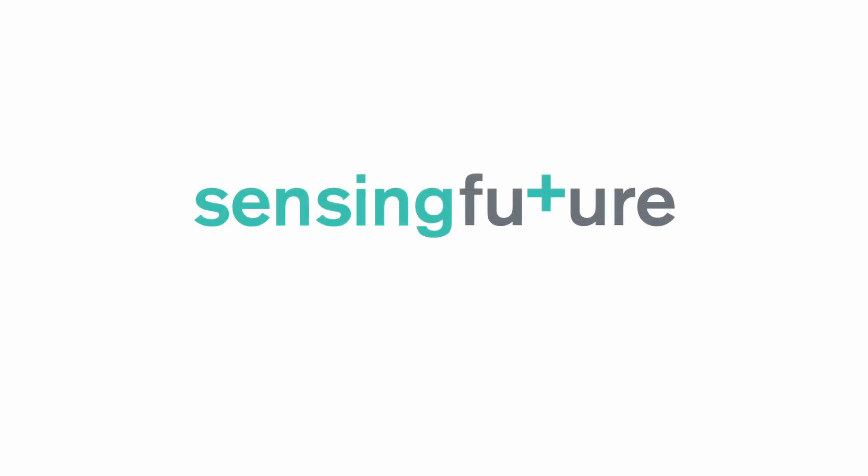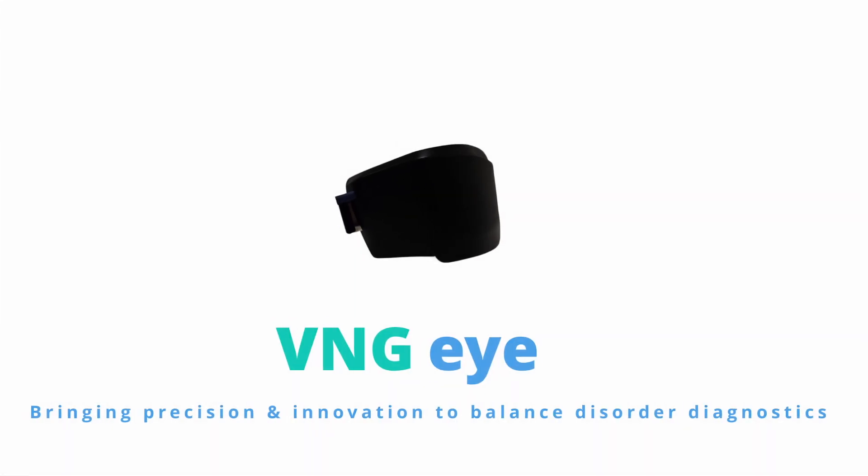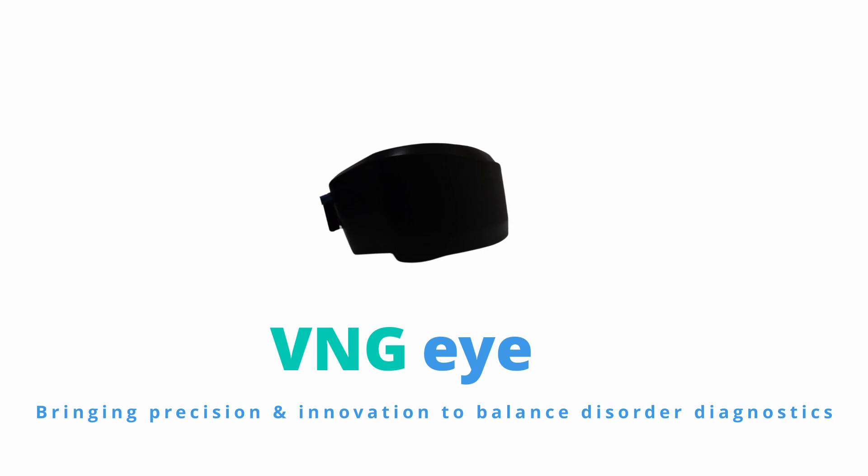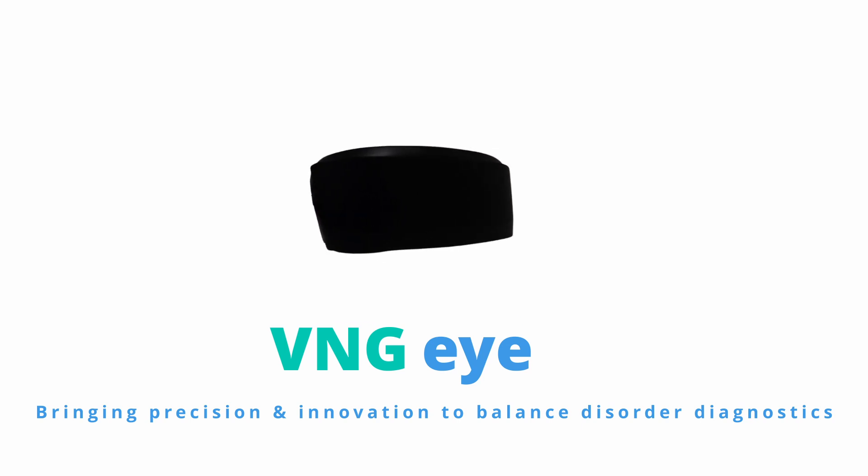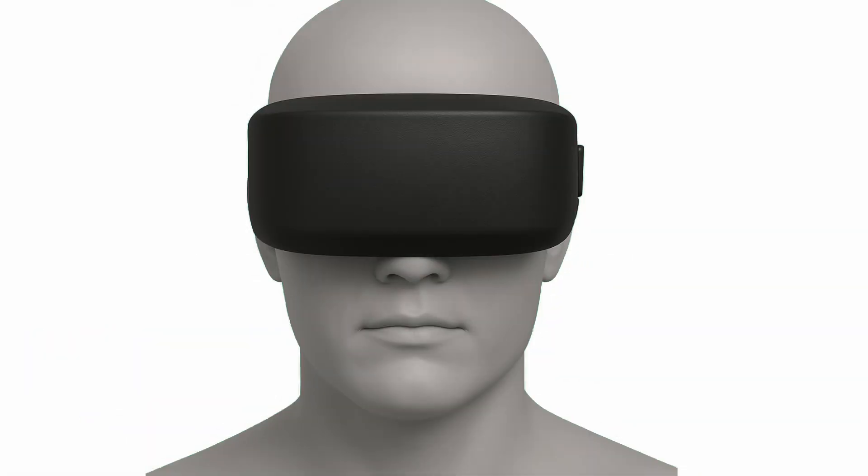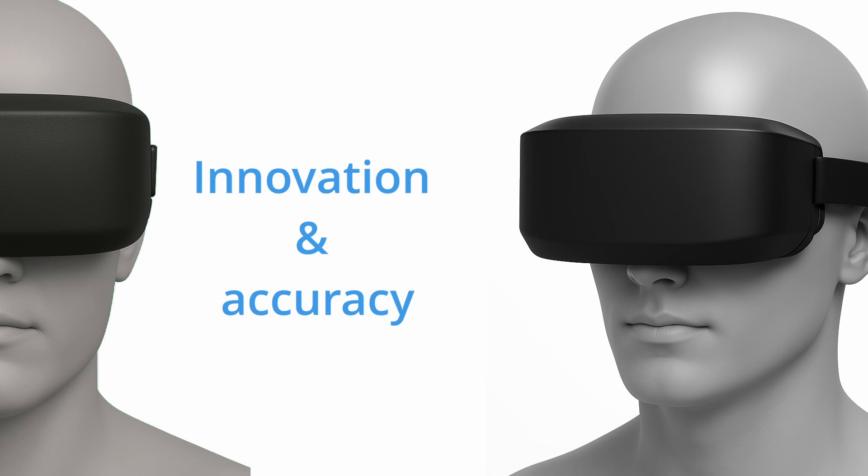Sensing future technologies. A greater step. Meet the VNGi, a comprehensive diagnostic platform for balance and vestibular disorders, combining innovation with accuracy.